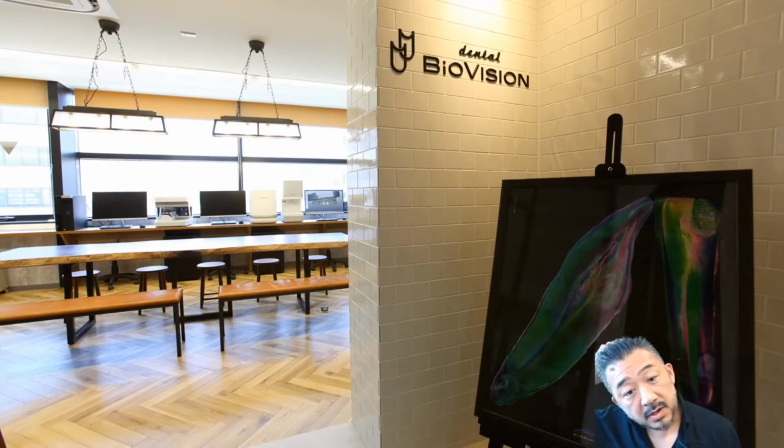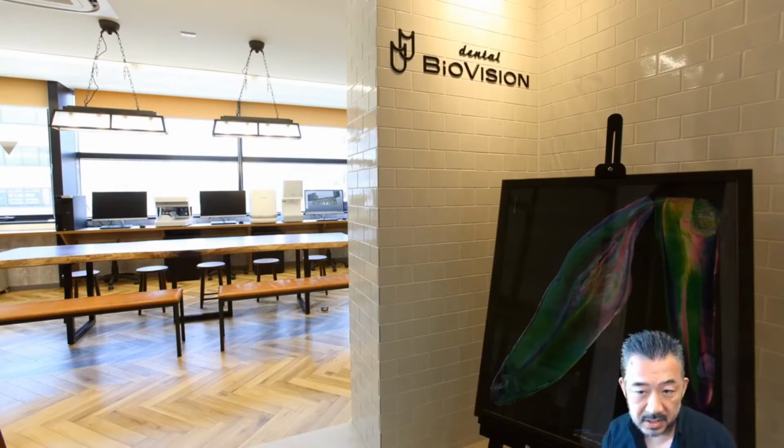There are 2 floors. The floor in this photo is office work and the CAD design. The milling machine and the 3D printer are also on this floor. It looks like a cafe, right?